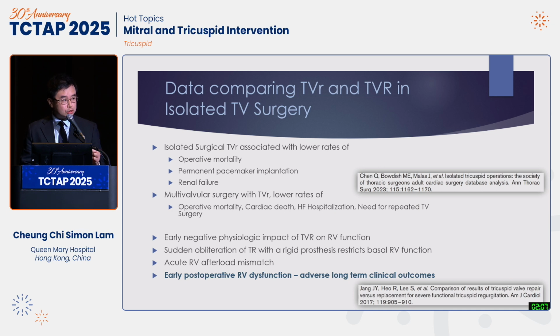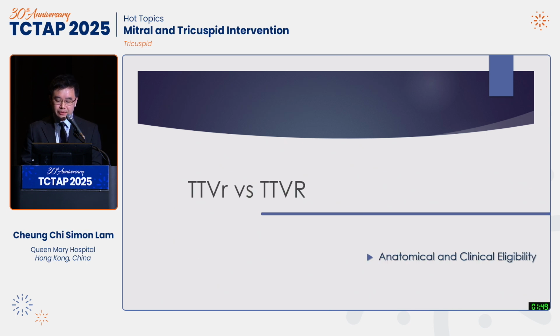So how to choose? Go back to surgery. I think replacement is always the second thing to think of. Repair is still the golden rule, no matter whether it's the mitral or tricuspid valve. Not only that, the result is better tolerated by the patient, especially those with RV dysfunction, and it's more physiological. And secondly, the complications are fewer.